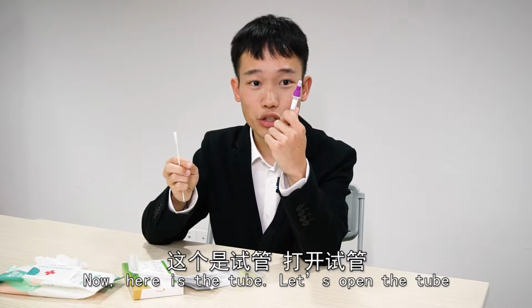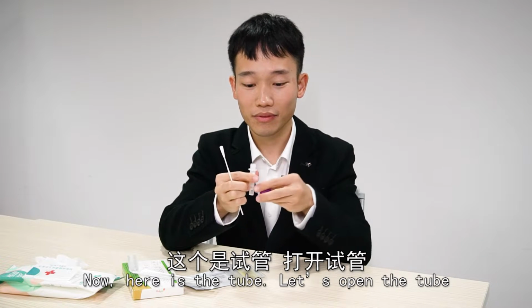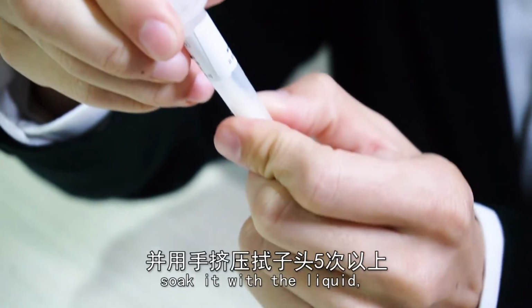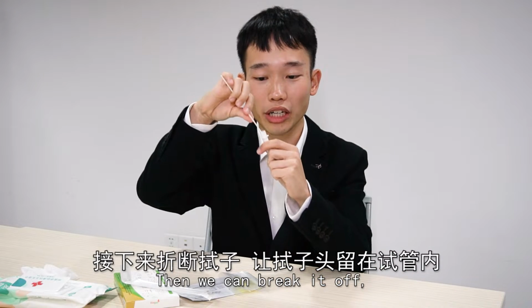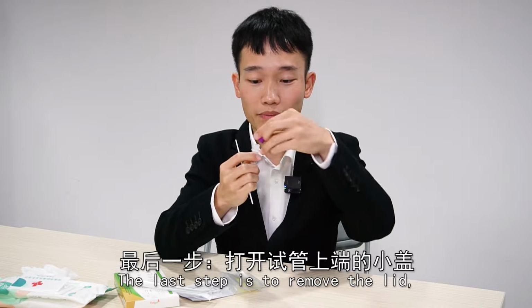Now here is the tube. Let's open the tube. Let's put the swab inside the tube. Soak it with the liquid and then squeeze it for more than 5 times. Then we can break it off. Leave it completely inside the tube.